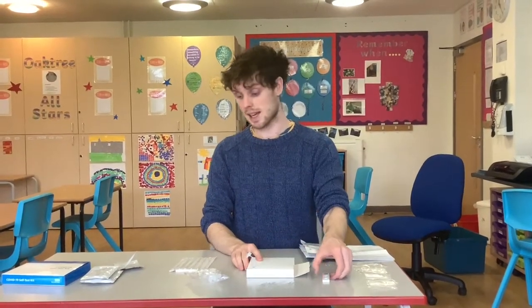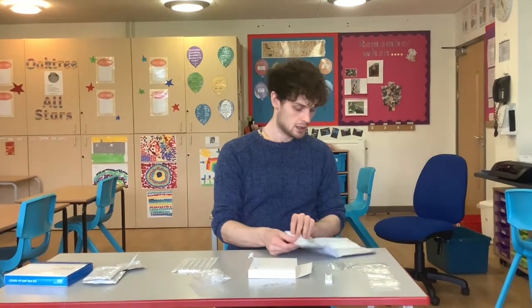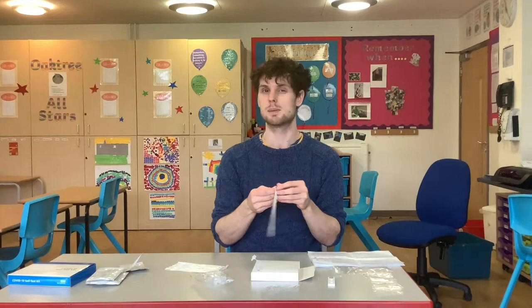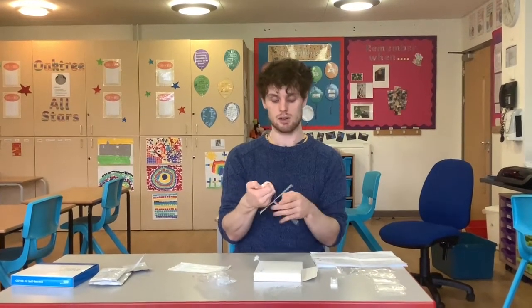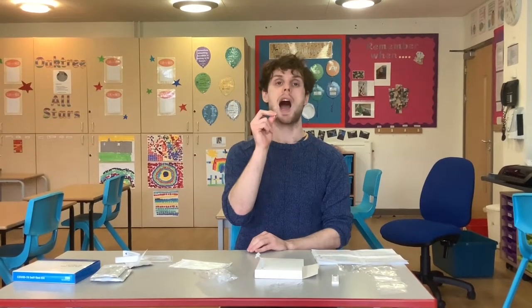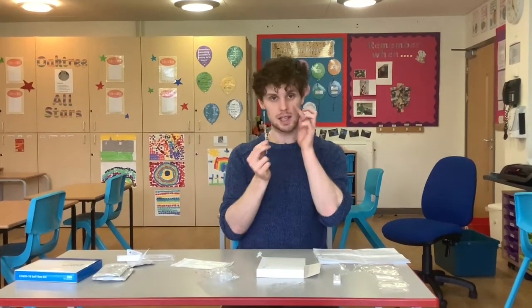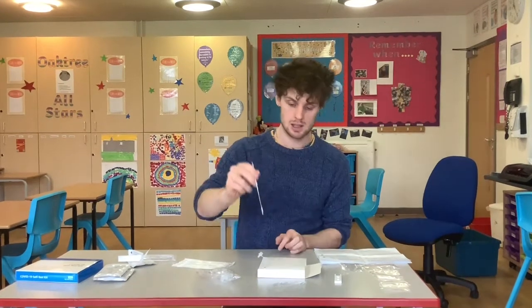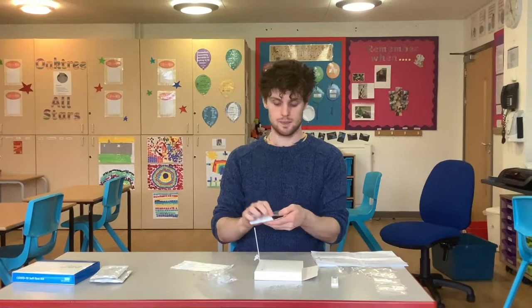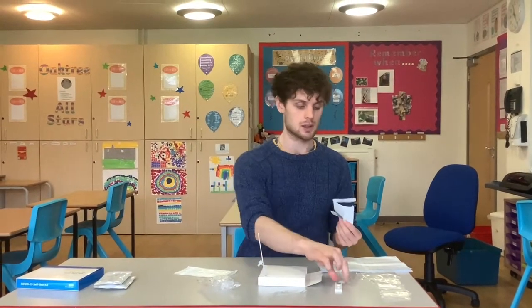Now you're all ready to go with your setup. The next step will be to take your swab sample, so you're going to take one of these swabs. You would swab the back of the throat on either side, then up the nose, and then place it into the test tube. These swabs you can just discard into a normal bin because they're not bio-waste.